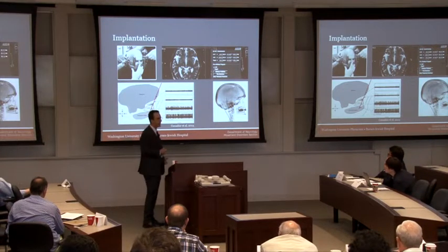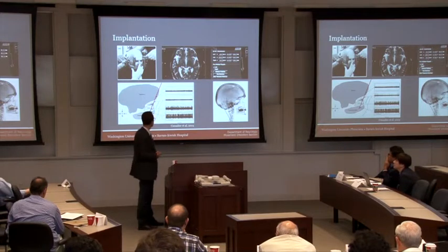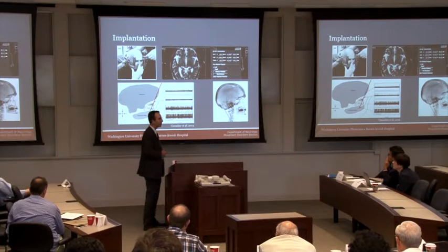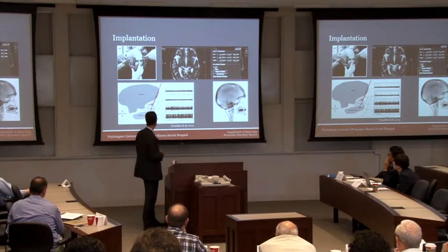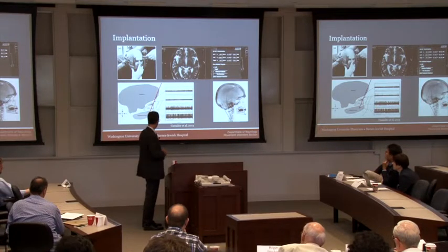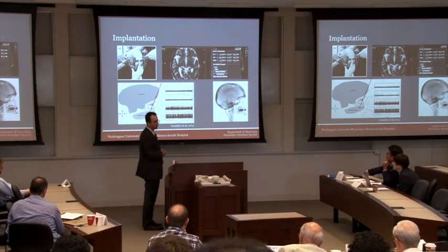This is the most important thing, I think, for this group here: I'm the neurologist, I'm in the OR, and I'm able to actually record neurons in the brain. I can record with my microelectrode, and I can also record local field potential. Our strategy is to place the microelectrode, or the local field potential macroelectrode, about 1 centimeter above the target. We drive it through these various structures.